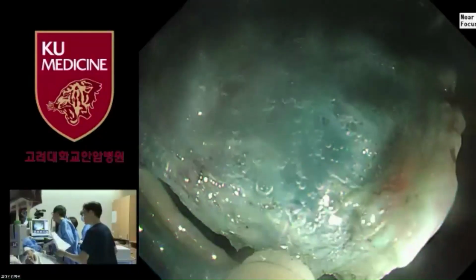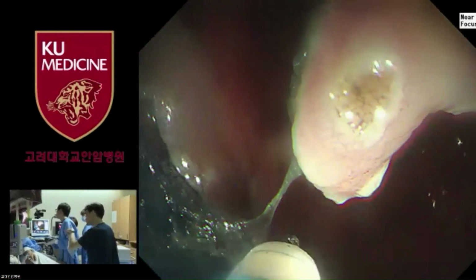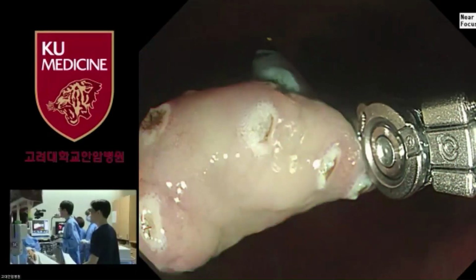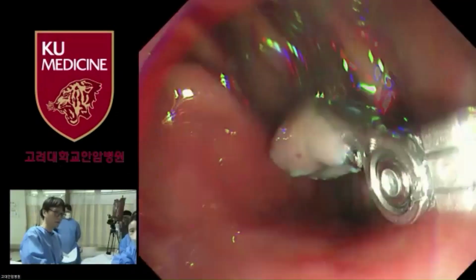And as you can see, as the ESD proceeds a little bit further, the specimen is moved upward more and more. Okay, to finish the lesion. Congratulations on your performance. And then we can just grab the specimen and remove it by the robotic device.